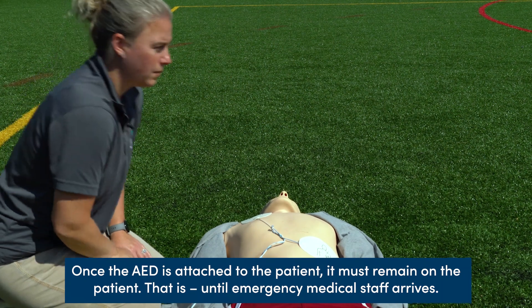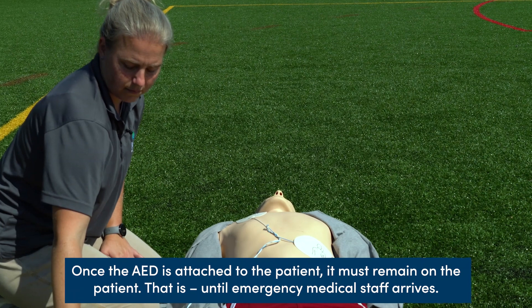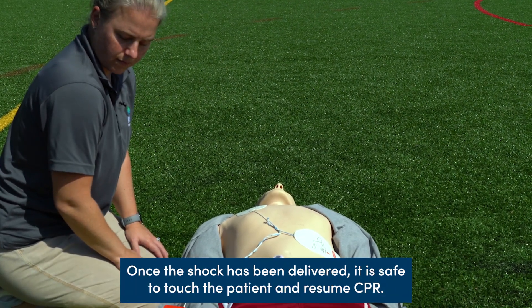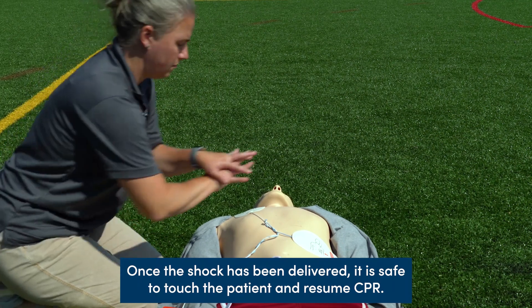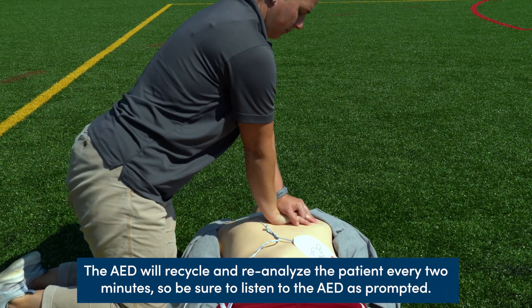Once the AED is attached to the patient, it must remain on the patient until emergency medical staff arrives. Once the shock has been delivered, it is safe to touch the patient and resume CPR. The AED will recycle and reanalyze the patient every two minutes, so be sure to listen to the AED as prompted.